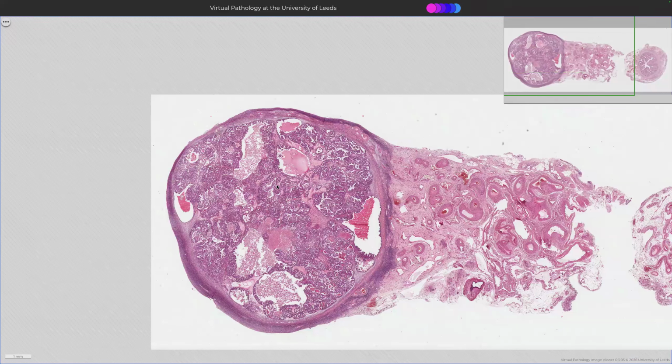All right. So if I was going to tell this from a serous carcinoma, I would do a P53. I would do an ER. I would do a napsin A. I would do a WT1. Okay, those are the most important things to do.